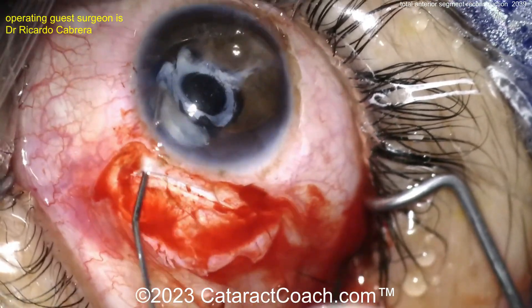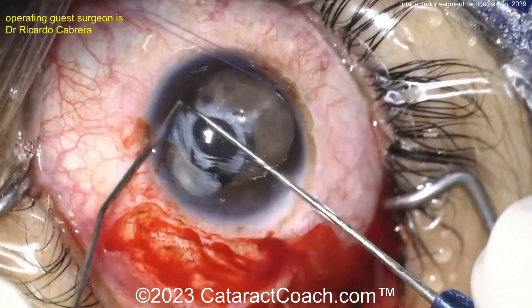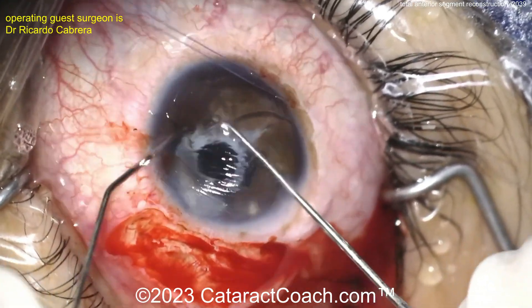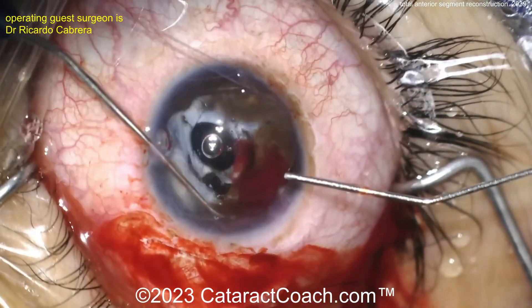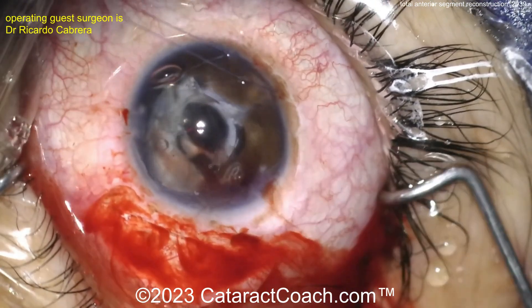There's the PMMA lens — it's going to require a big incision. There's a lot of scarring of the capsule. Who knows what's going on in this case — tough, tough case. Getting that lens out is probably the first priority, and then we can focus on figuring out the rest of the case.